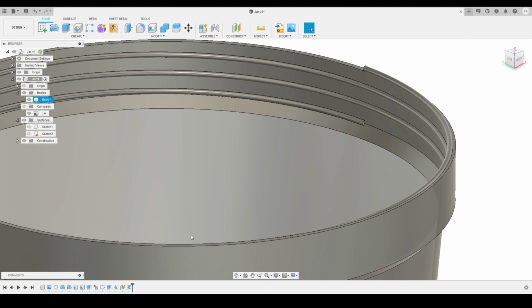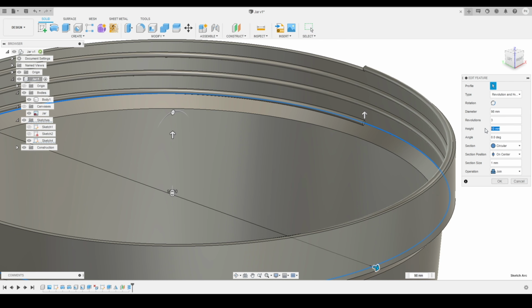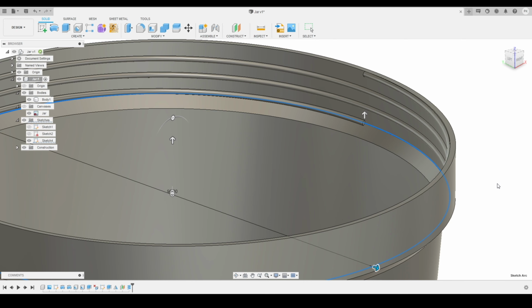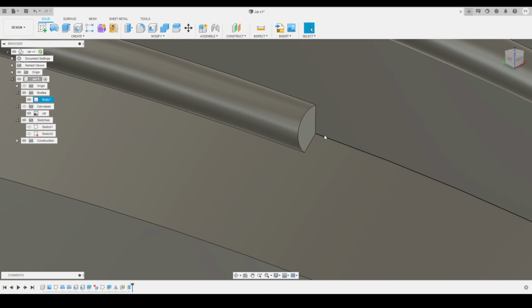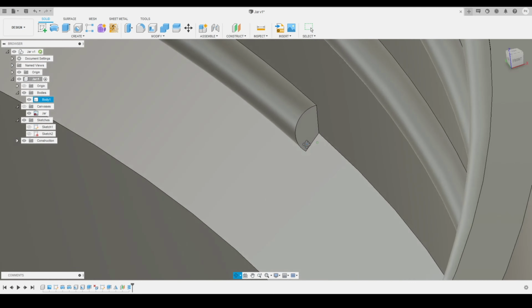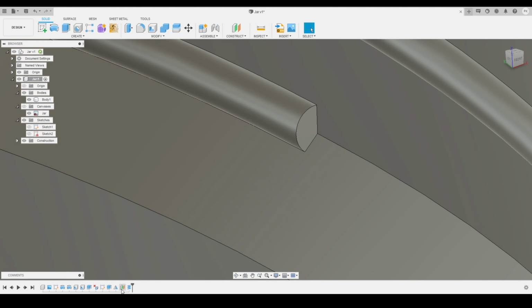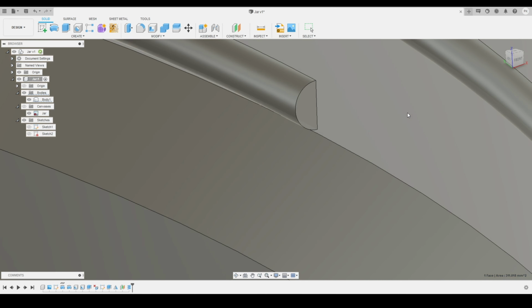So here you can see, and if I zoom in on the area, before that I will just change over here this one as 9 as well, the total height of the coil, and we'll try to zoom in on the area and we'll see if this is good. Okay, so there is still a problem, it is still going on to the corner. So I don't want it like that, I want it completely above the corner. So again I will change the position of the offset plane. I will give it as maybe minus 9 millimeter, and here you can see now it is above the corner plane. So now it is good now.